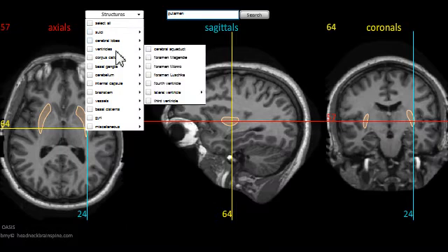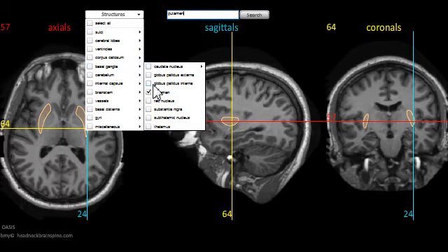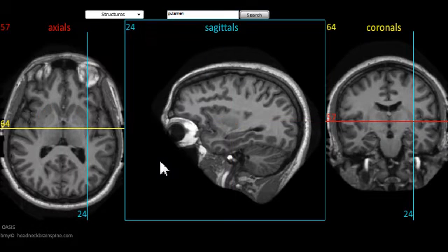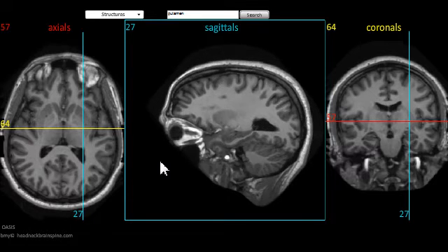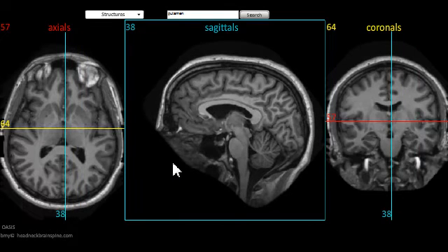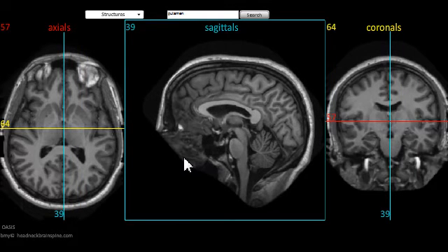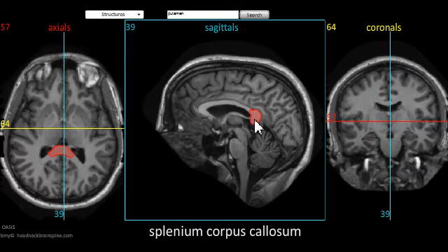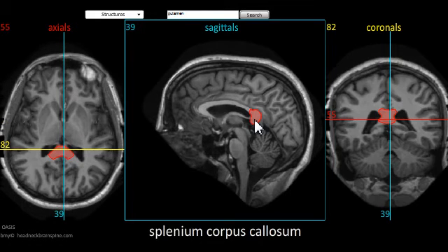It can be turned off by finding it in the basal ganglia drop-down menu and deselecting it. Say, for instance, now you know where a structure is but you don't know its name. You know where the corpus callosum is, but you've forgotten what the posterior aspect of it is called. Find the corpus callosum on an image, go to the posterior aspect, and you see that it's called the splenium of the corpus callosum. Click on it and it will sync it in all three image planes so you can appreciate it there as well.